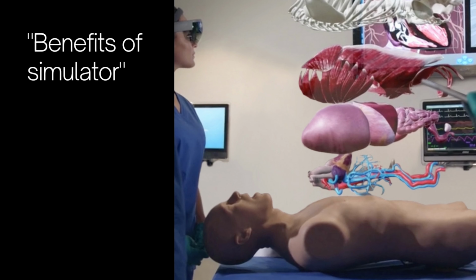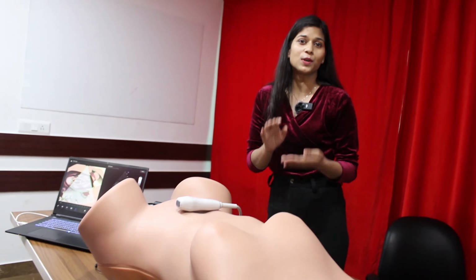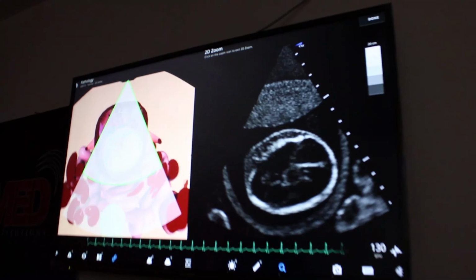So when it comes to the benefits of simulation, we can work on any scan, from a normal scan to any pathological scan. And one more benefit is that our simulator never gets exhausted. You can practice as much as you want, and work on as many pathologies as you want.